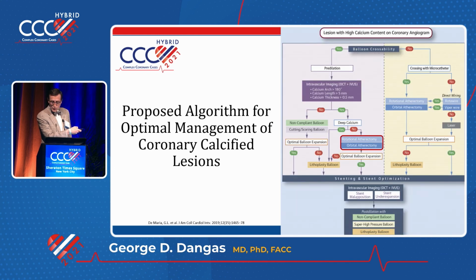If still the answer is no, in the very, very rare cases, Dr. Sharma quoted 1 in 1,000, it may be a couple more than that, you may pull out of your pocket this laser bombing that I explained before as a general idea. And ultimately, you're going to end up reaching the optimal balloon expansion. And then again, you potentially utilize lithoplasty later to make it even better.